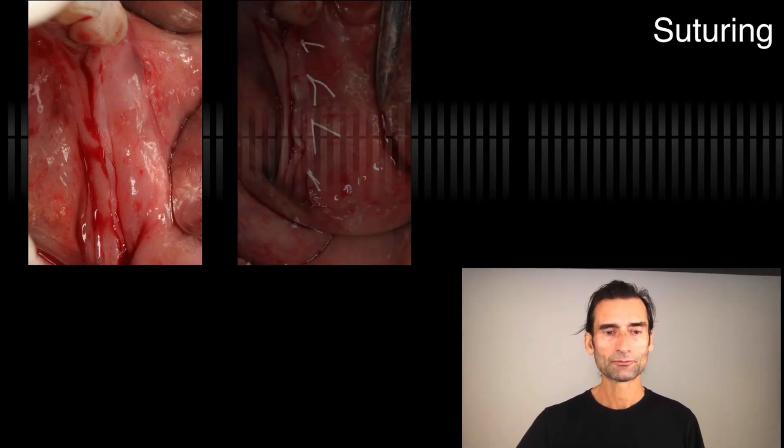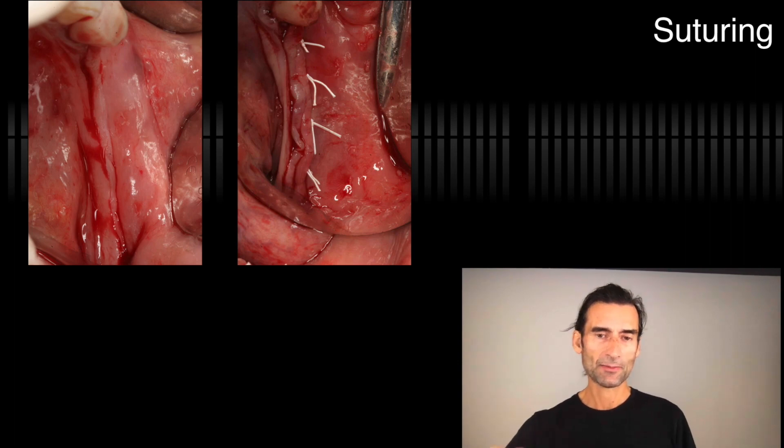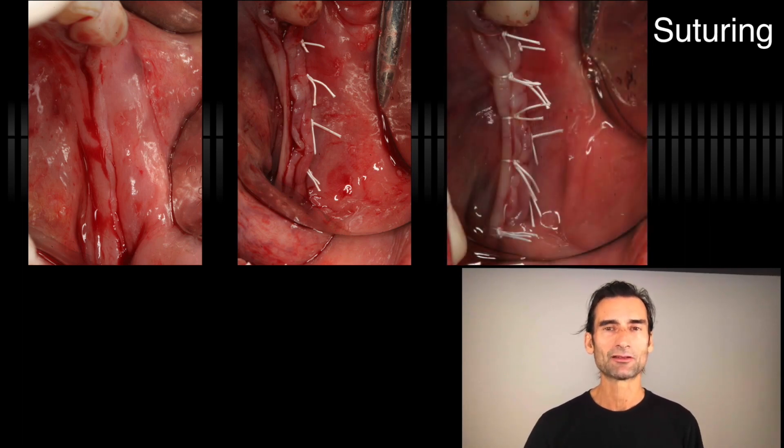Here's another one — the horizontal mattress on the mandible. The knots are placed on the buccal, about three to four millimeters apical. In between each, you have a single interrupted, which makes it really nice and controllable. That's enough — you don't need to do more. I placed probably six or eight sutures maximum.